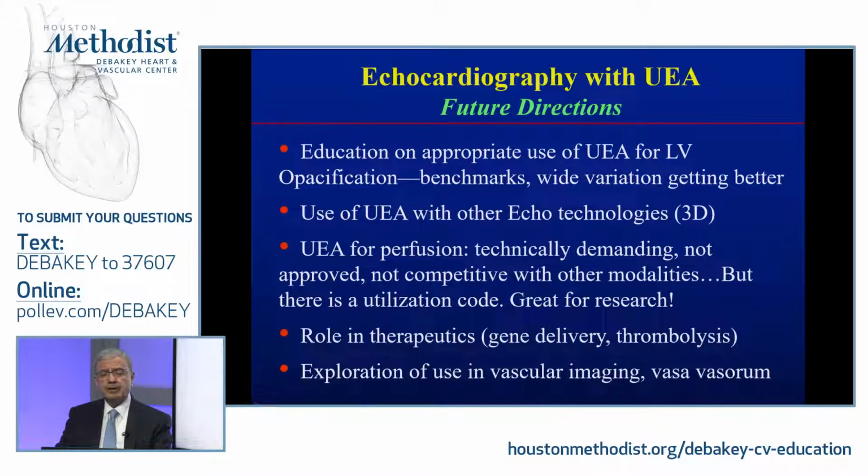The push for appropriate utilization is quality of the echocardiograms that you're getting, and also the impact, as I showed you, on diagnosis. And if you have an impact on diagnosis, you will have an impact on management. So I'm very happy and very pleased that the appropriate utilization is going on more and more, particularly in the United States and throughout the world. So I think it's important to decrease the variation, and I think that is much better nowadays.